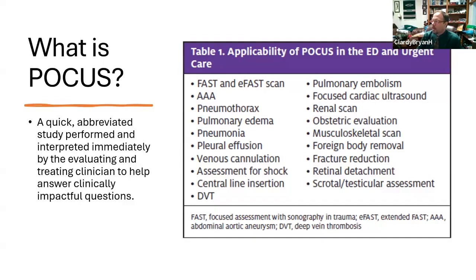Okay. And I've had twice in the last 2 months opportunity to do scrotal or testicular assessments looking for blood flow. And that's very reassuring when you can compare two testes, one painful and one not, and determine they both have the same blood flow. And you're not dealing with a torsion at that point. So that's great.